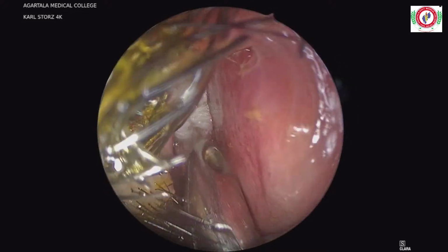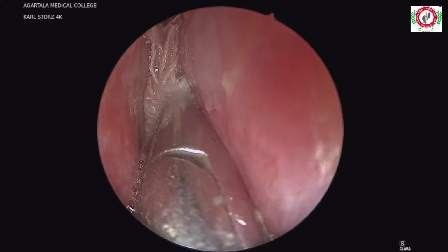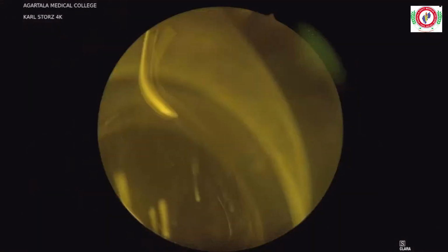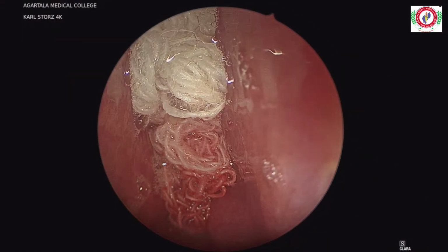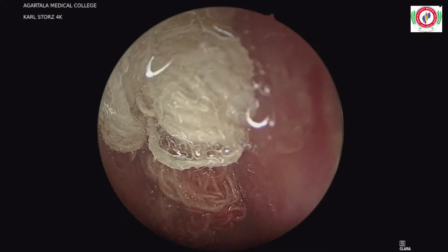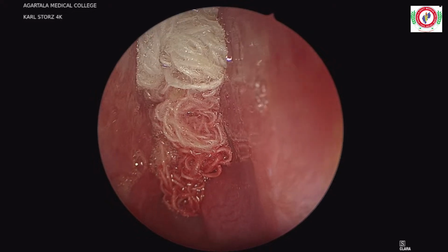So we have an adequate BP, 126/76. I would like to reduce it a little more. The heart rate is 95. I think we can request our anesthesia. If otherwise, we'll go ahead after that. In this case the approach will be a little different.